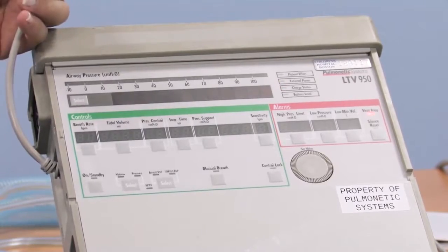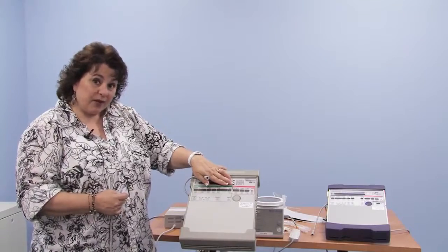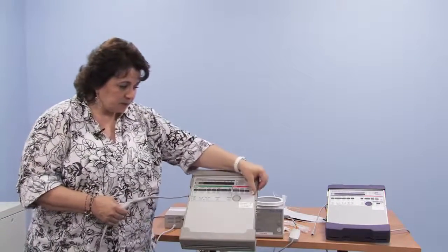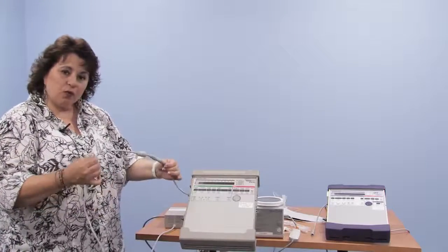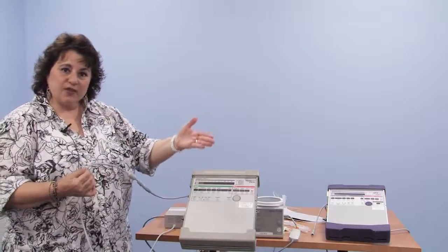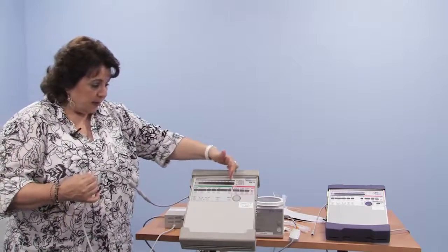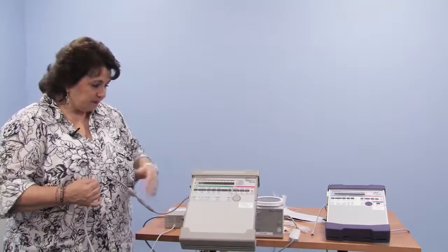So when I take away external power, there are no lights. When we turn it on, we'll only see the battery level light. That's only indicating the internal battery of the machine. So if you're at home and the machine is running and you glance over and see just the battery light on, something's wrong with the power from here outward. Either the plug has come out, the battery's gone low, something has come loose. And there should be an audible alarm for that, but in the event that you missed it, if you glance over and see battery level, that means you're on the 1 hour internal battery.